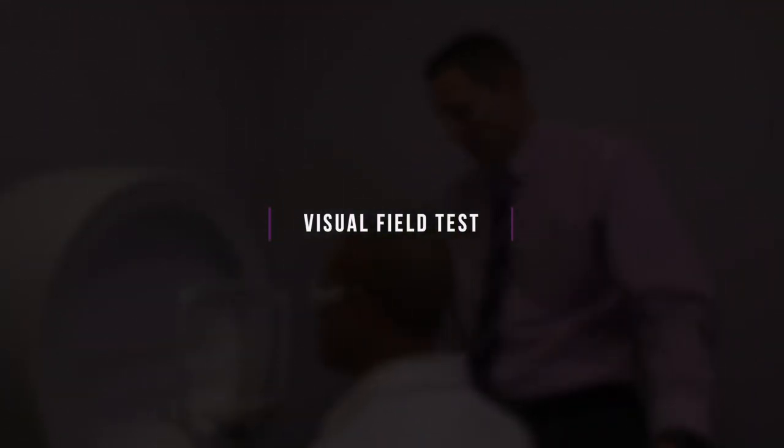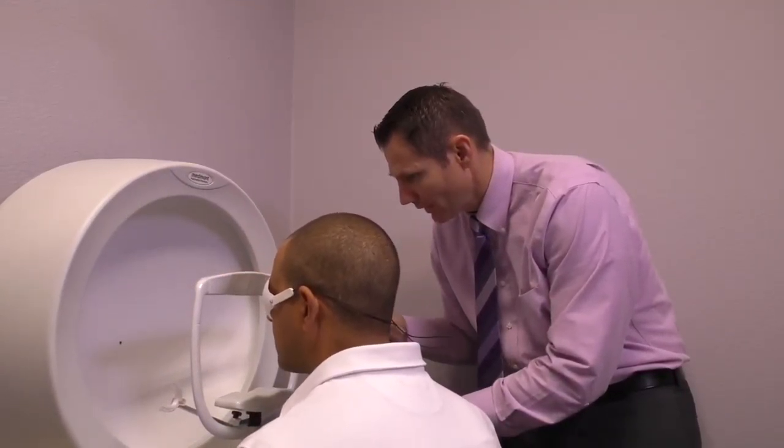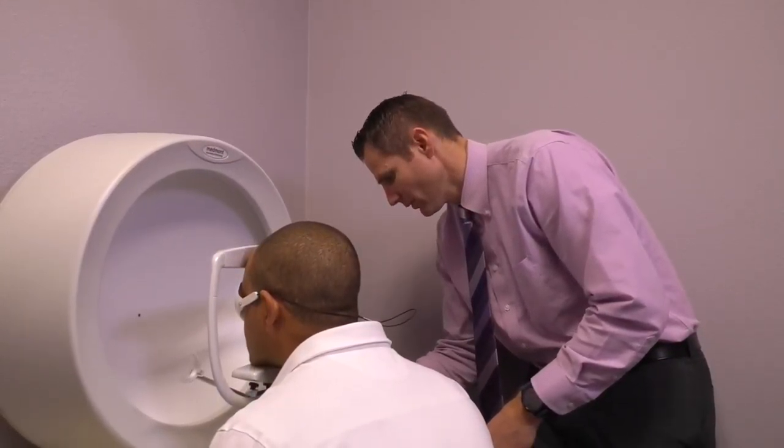So Mr. V, what we're going to do is your annual visual field test here. This is the one where you're going to look at different points of light as you're looking straight ahead. Bring your chin in there, forehead against the forehead rest there.